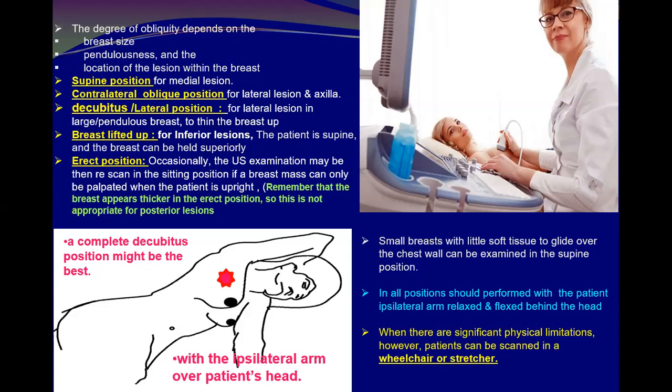But if the breast is pendulous, or a huge breast, then you might need to put the patient in the lateral decubitus position to evaluate laterally located lesions.